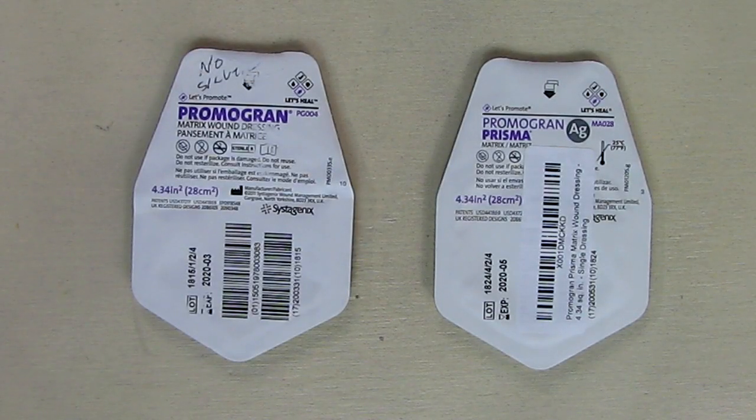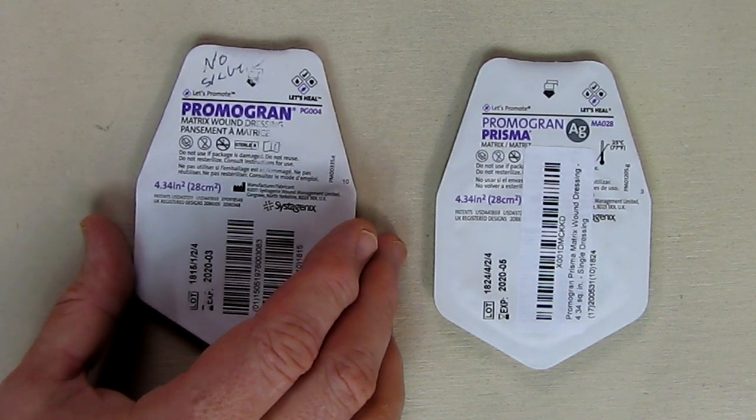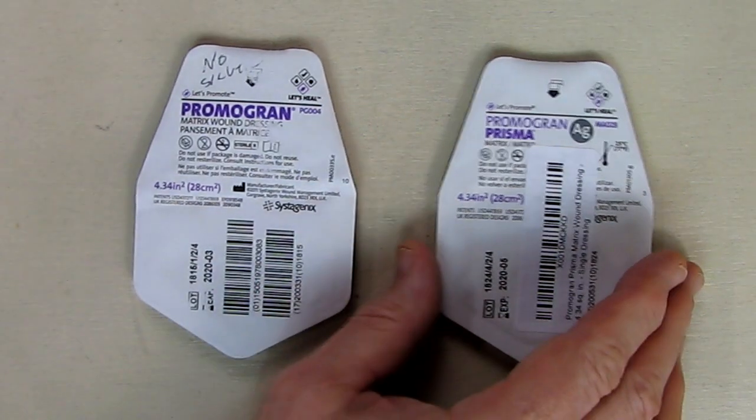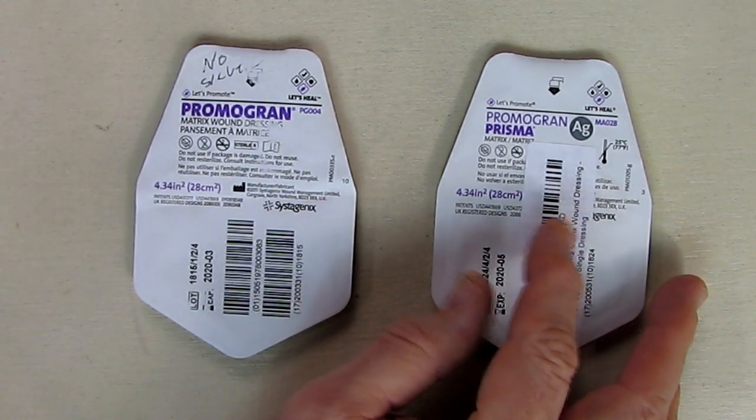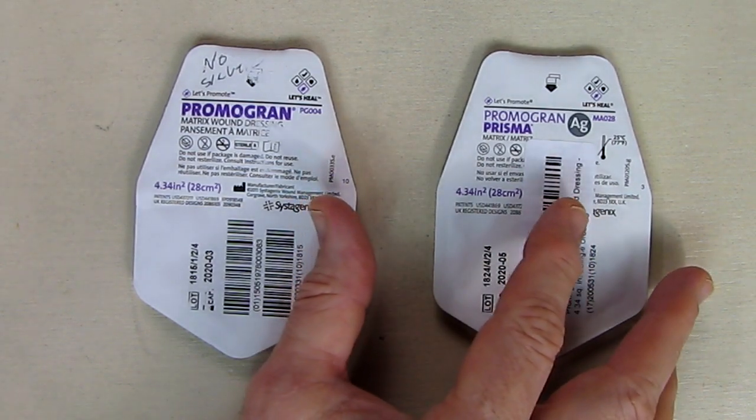Hello again, this is Robert Veach here. This is my review of two products which are very similar. One is called the Promogran Matrix Wound Dressing. The other one is Promogran Prisma, which is also a matrix wound dressing that has some other ingredients in there — some silver.